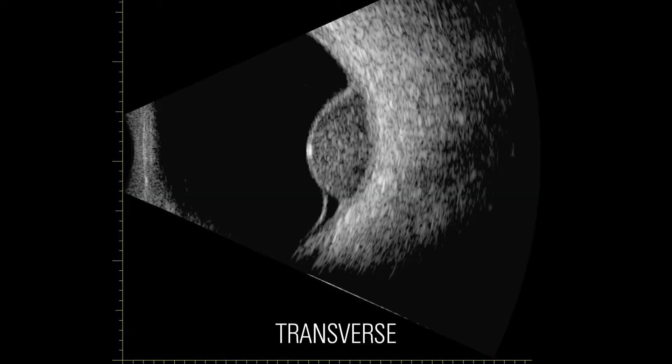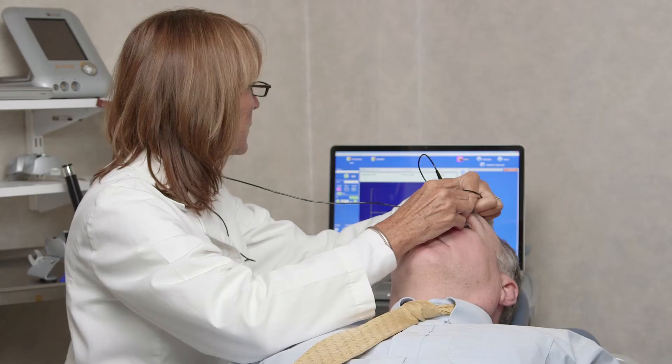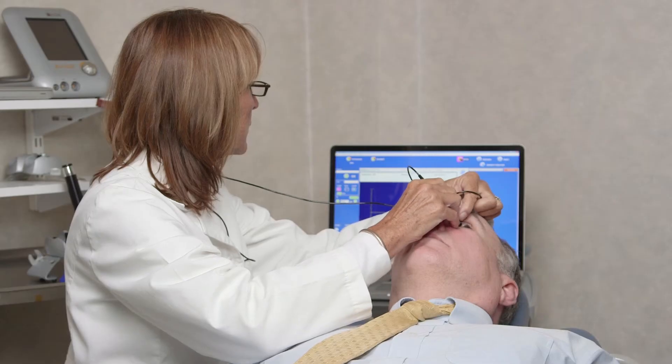By working systematically and performing both transverse and longitudinal scans, we can get an idea, for example, of the size and shape of an intraocular mass.